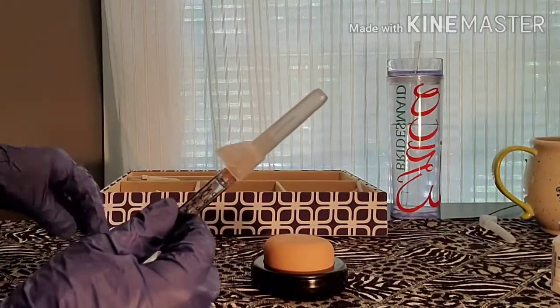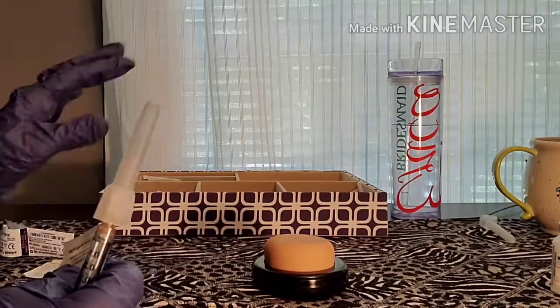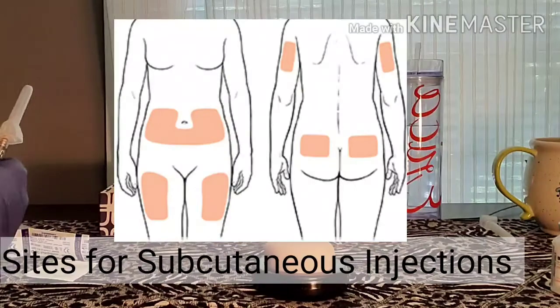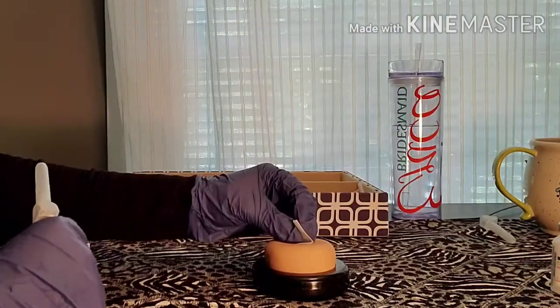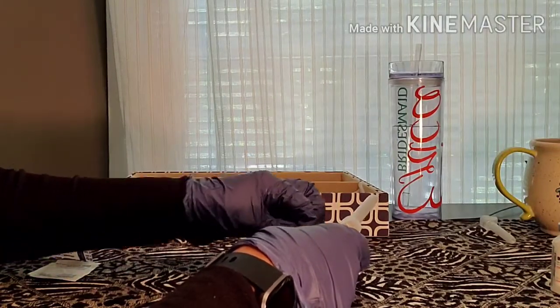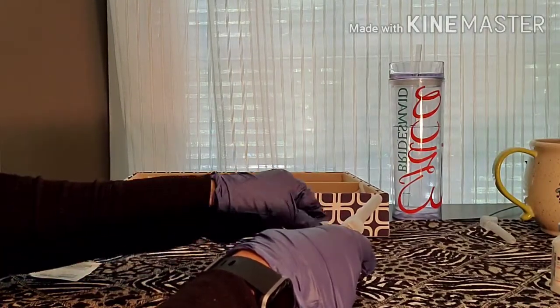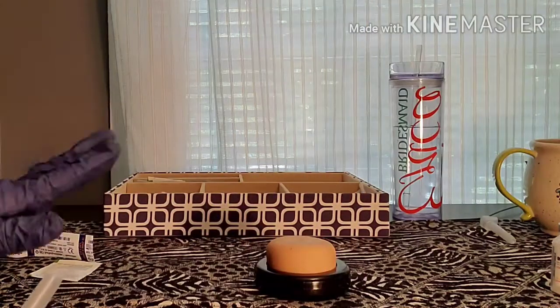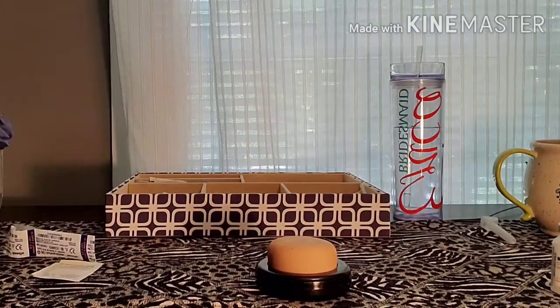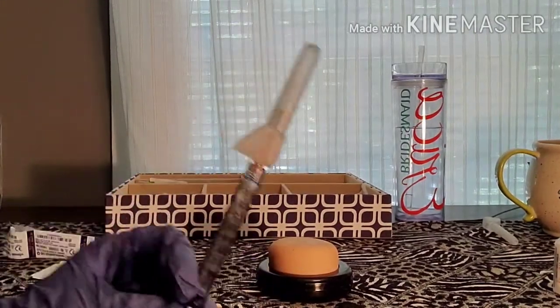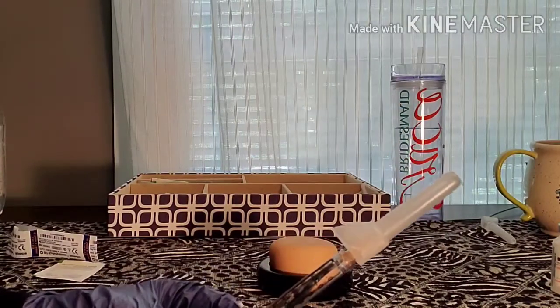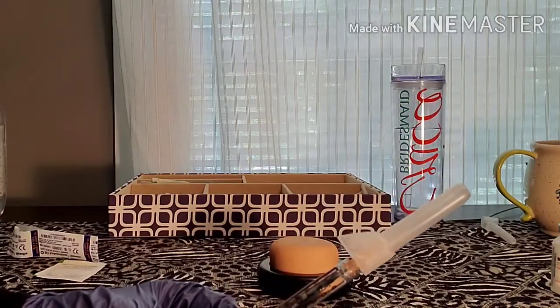I'm going to the abdomen. I'm going to start exactly where I intend to insert the needle and clean in a firm circular motion outward — not going back in — then let it air dry. I'm not going to fan it or dry it; I'm going to let it air dry.